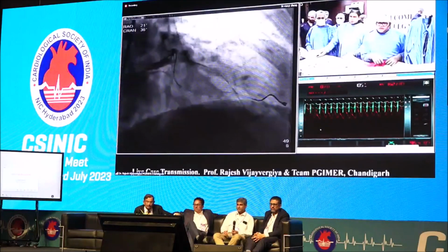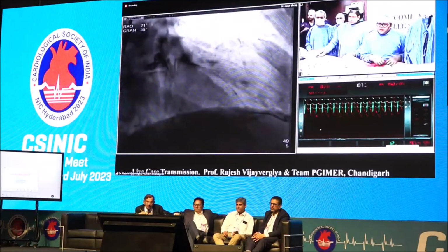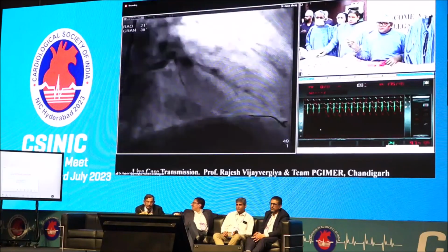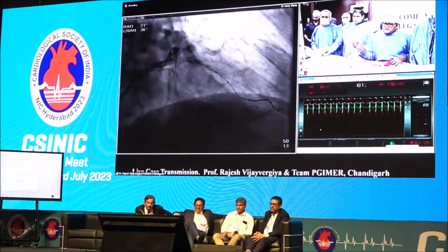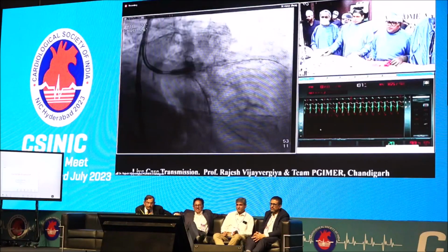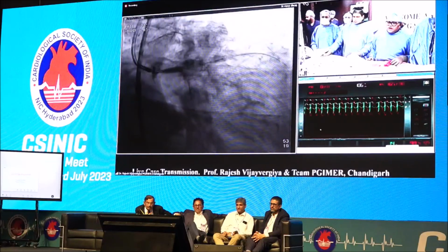See, this result what you are seeing over there is just after putting the stent across left main to LAD and the mid LAD. So can you go to the next view? Next view. And here is the post dilatation of the LAD with the 3 millimeter NC distally. Next. And this is 3.5, and then we had a POT with 4.5 across the left main.